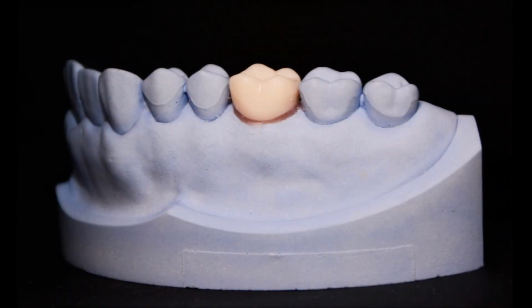For the fabrication of the pontic of the provisional, fix an acrylic tooth using modeling wax in the edentulous space on the cast. Ensure that the occlusal level and buccolingual alignment conform to the arch.